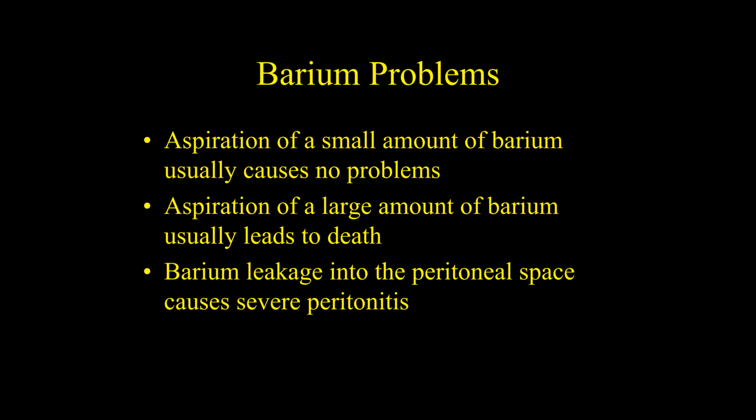Problems with barium. Barium, if you aspirate it and get it into your lungs, can kill the dog, okay? Barium is not good if you get it into the lungs. And so you've got to make sure the dog doesn't aspirate it. If you get a little bit of it, a couple cc's in the lungs, that's probably not a big deal. But if you get much in the lung, then it's never going to come out. There's no way to suck it or vacuum it back out, and it's going to be there forever. And it will interfere with oxygen exchange in that portion of the lung. So that's not a good thing.